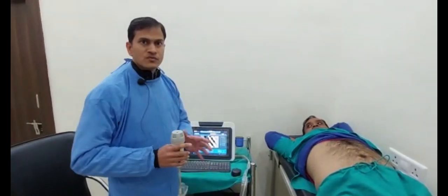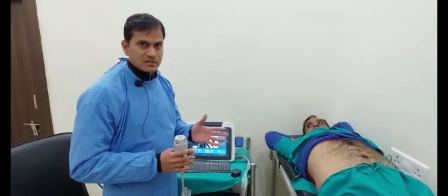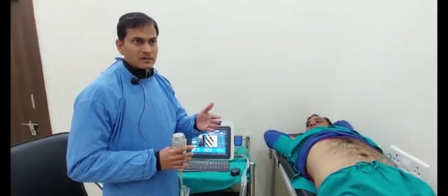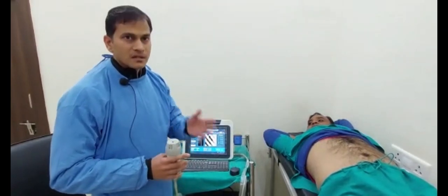Basically, this machine is used for the early diagnosis of liver diseases and to differentiate between liver diseases like CLD, NCPF, and EHPVO.